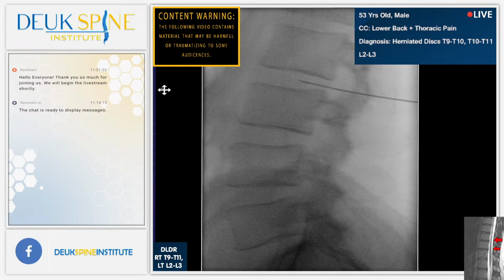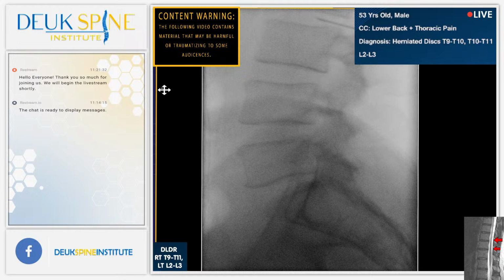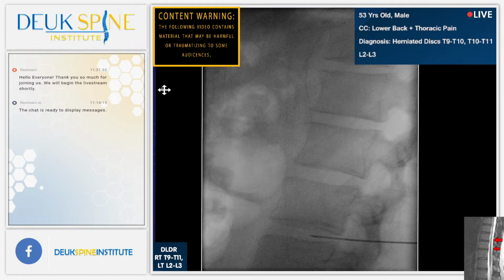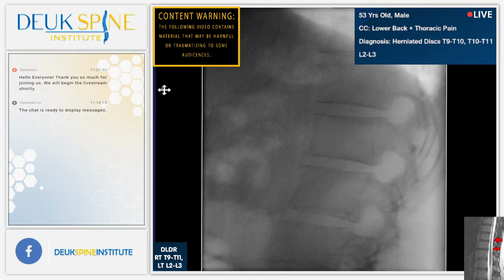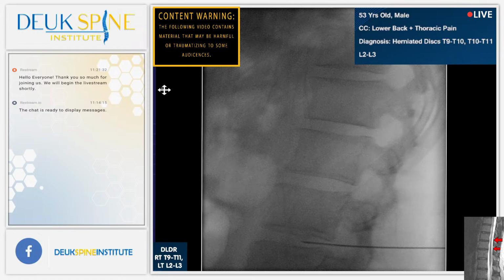Just check one more time. So, folks, we do a lot of checking for levels because, frankly, we don't want to operate on the wrong level. Just go down a smidgen so we can see the sacrum and verify. There's the sacrum. Count 5, 4, 3, 2. I think there's no doubt we're at the 2-3 disc. Now we're going to keep going up with a lateral view. I want to see 2-3 at the bottom. There it is. You can go a little bit further. Shot. Oh, it's too much. Let's come south. All right, so we know that's 2-3.